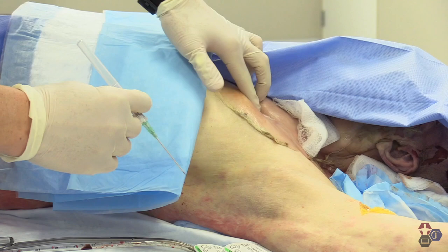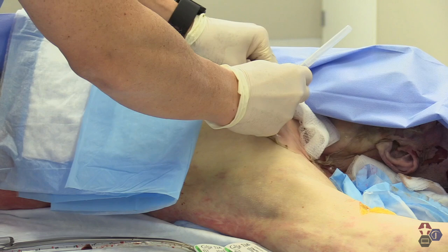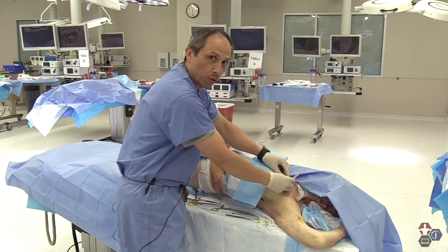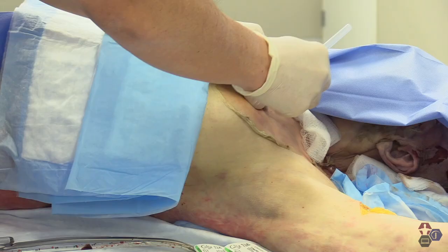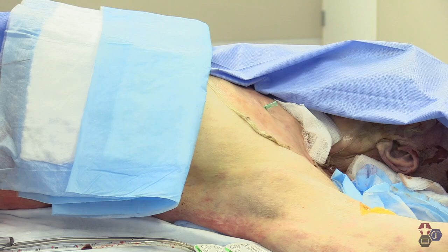From here, you palpate, find the clavicle, second mid-clavicular line, and insert the needle. Once you insert the needle, you obviously feel a small whoosh of air. From here, remove the needle, and now the procedure is complete.